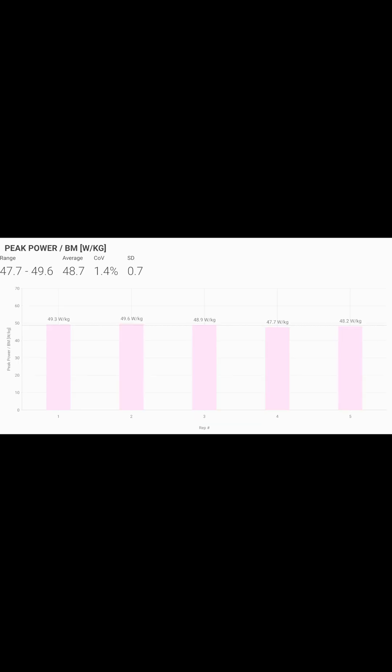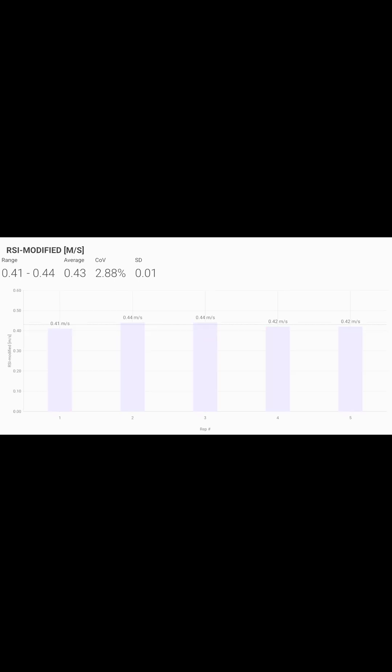The next metric that we look at is peak power. There are recommendations for a return to sport from lower extremity injuries for peak power, but again, we want to see an upward trend through our testing blocks.